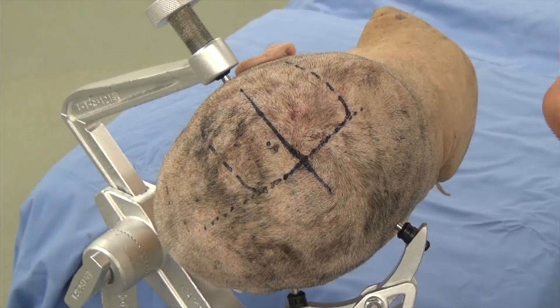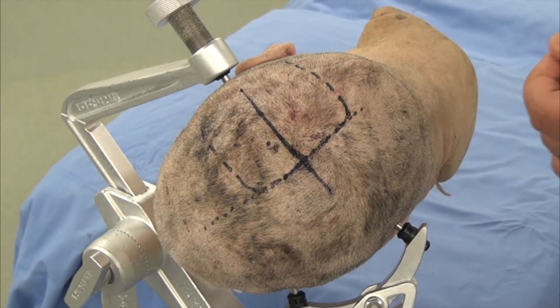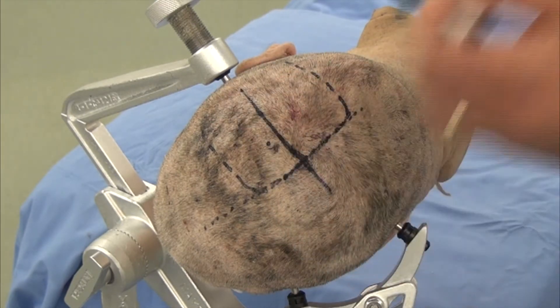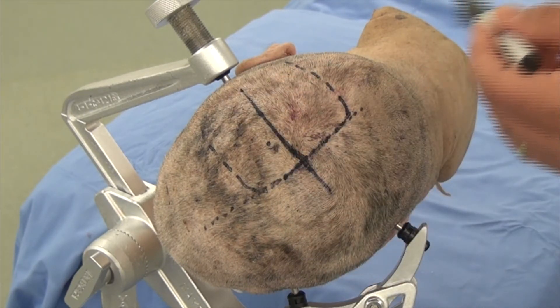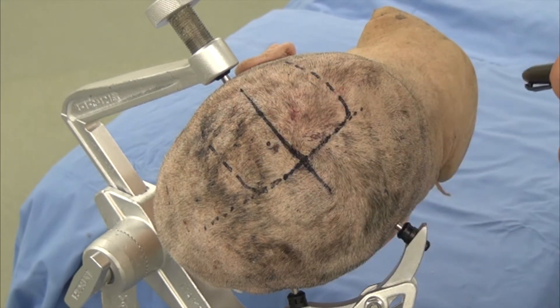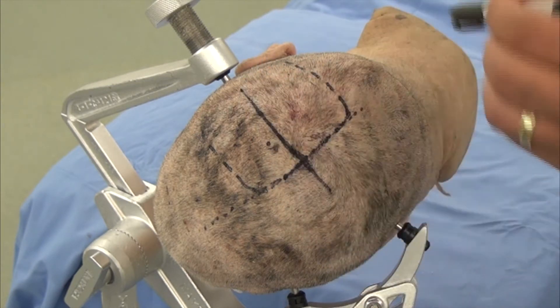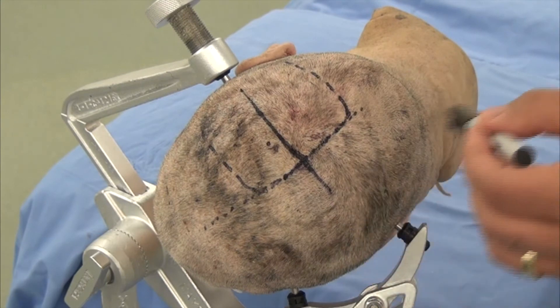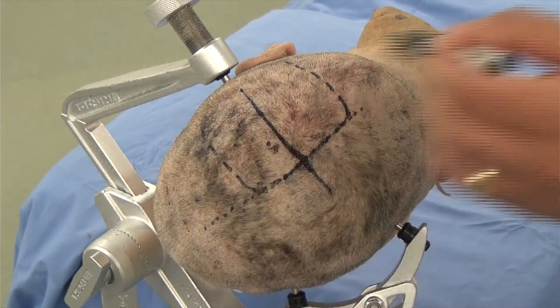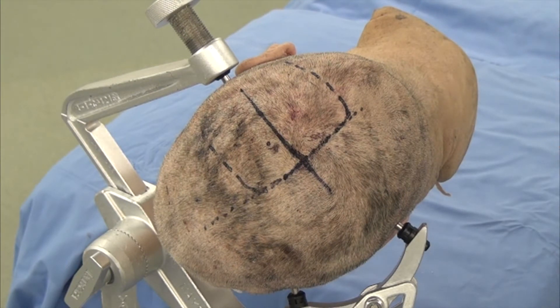The incision for a parietal craniotomy consists of two different incisions most commonly. One is the curvilinear incision that offers ample exposure along the parietal bone, or as a second option, a linear incision that crosses the midline. The linear incision, if extended slightly medially and laterally, would provide ample exposure similar to the curvilinear incision, with potentially less area of incision to be closed.